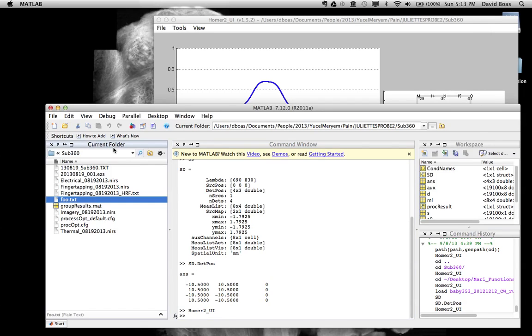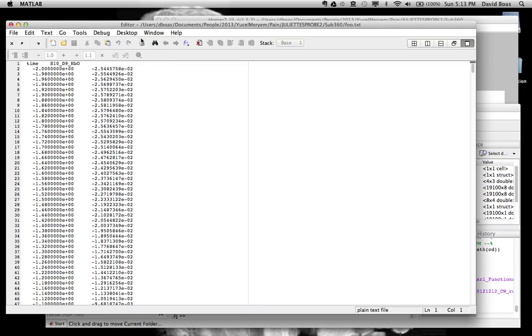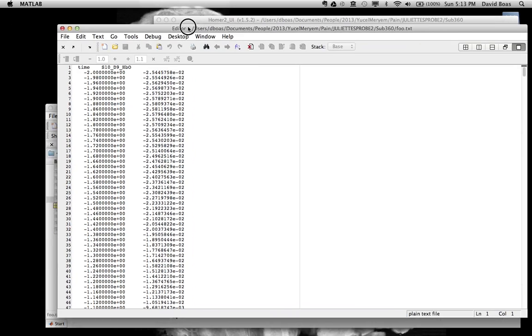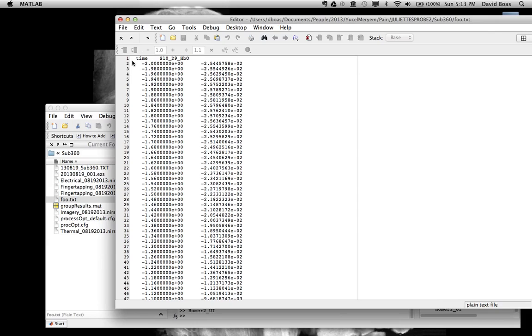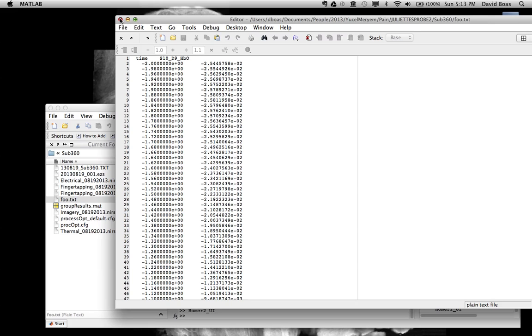Let's open it up so you can see what it looks like. You can see here it gives you a time vector, all the time points for the hemodynamic response function. And then you can see the oxyhemoglobin. That's what I had clicked on. And the concentration changes for all of these time points. And it's labeled so you know which source and detector it was.